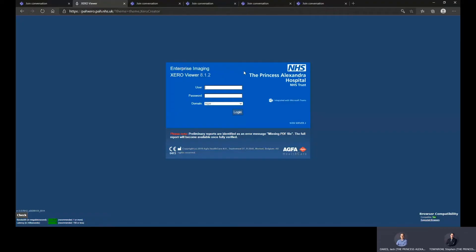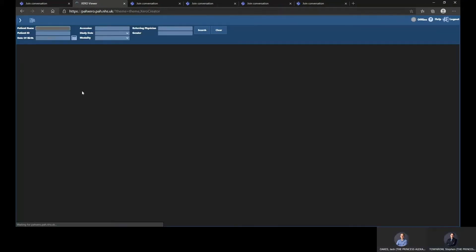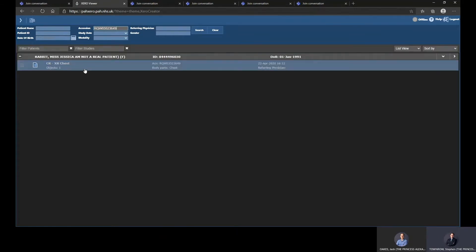We will follow up this integration with a second innovation we have introduced for high-quality image sharing and collaboration within Teams. We're going to do a quick demo on our trust system here. I'm going to quickly log in to Xero. We've got a pre-prepared test patient, so we'll click on here.